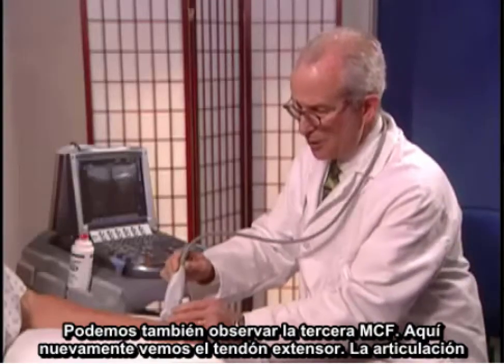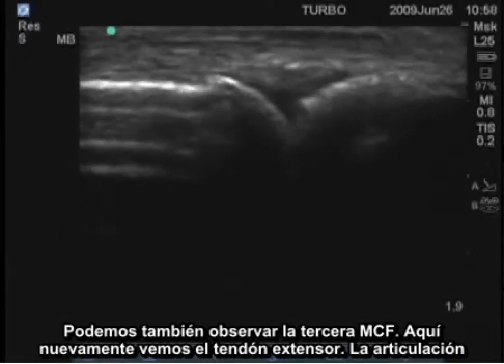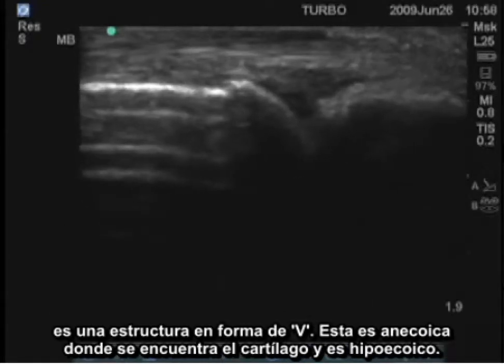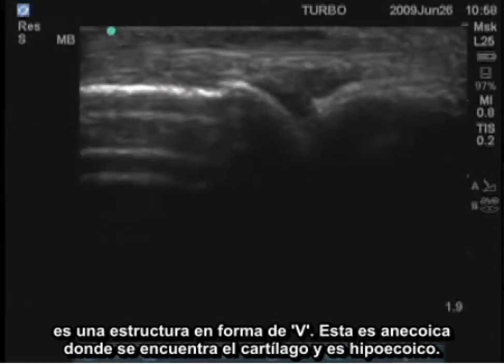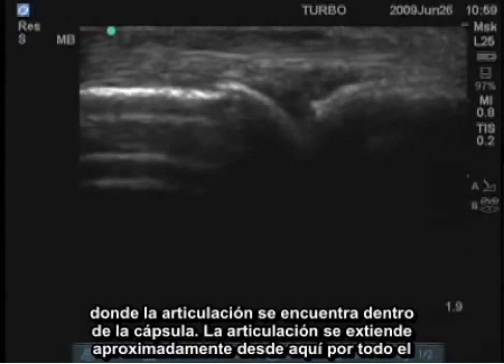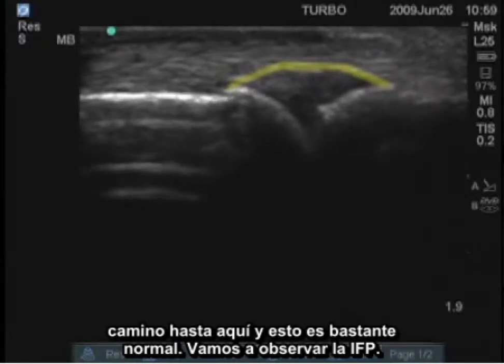We can also now look at the third MCP. Here again, we see the extensor tendon, the joint, this V-shaped structure. This is anechoic where the cartilage is, and hypoechoic where the actual joint material is within the capsule. The joint extends from approximately here all the way over to here, and that's quite normal.